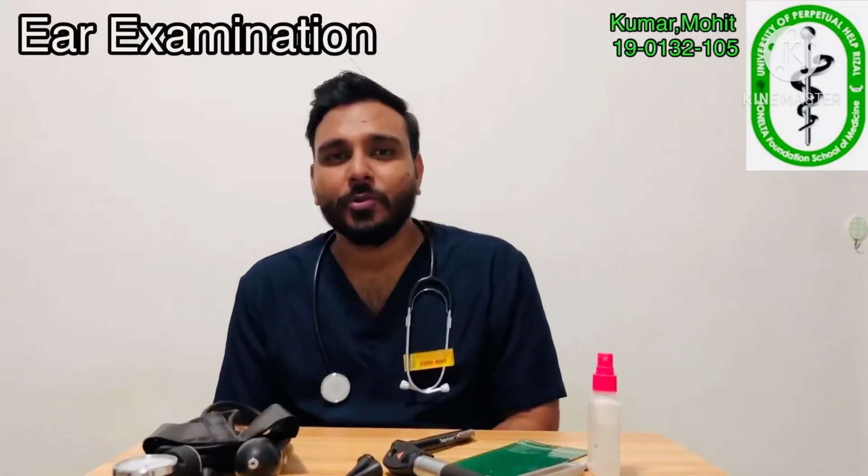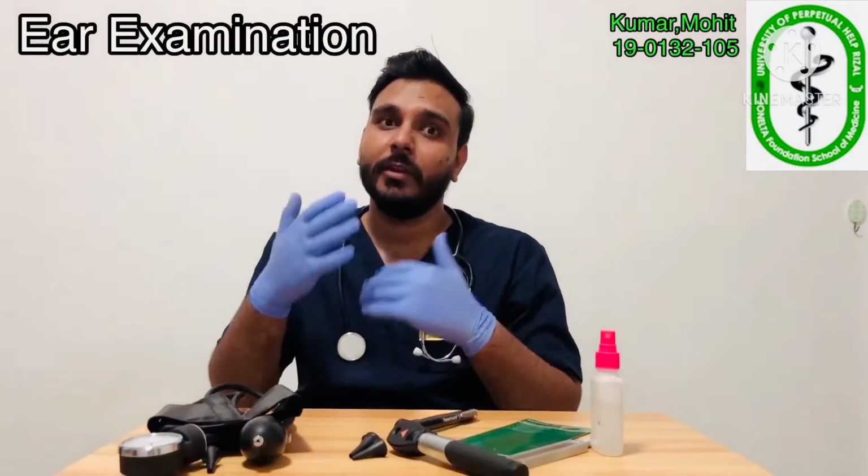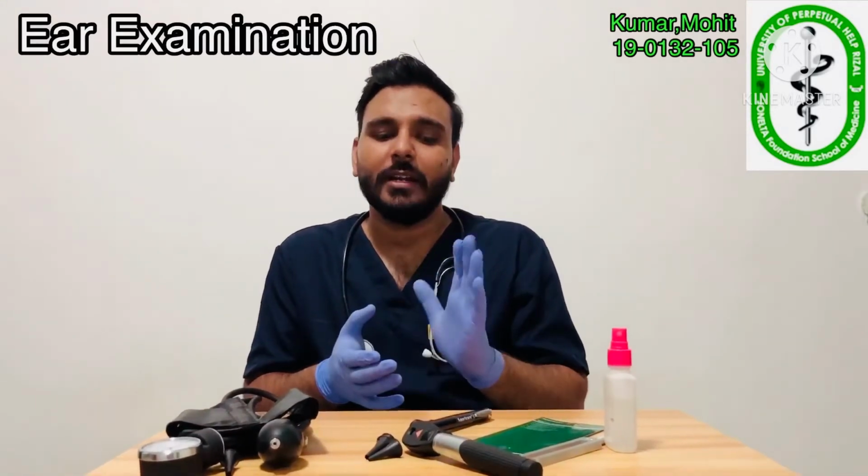So now we are going to examine the ear. We will follow the same pattern. First of all, we will go through the external structure of our ear. At last, we will look inside the ear with the help of the otoscope. Alright, let's start the demonstration of ear examination.